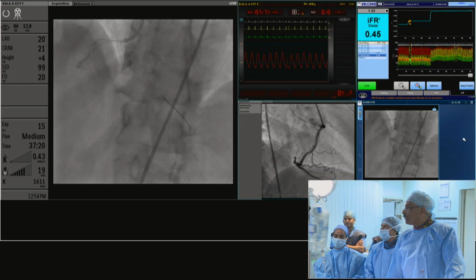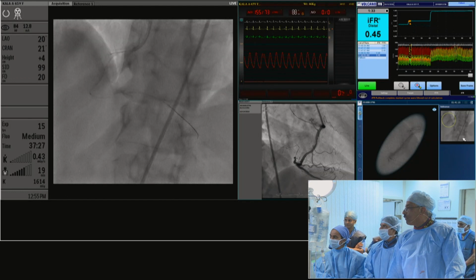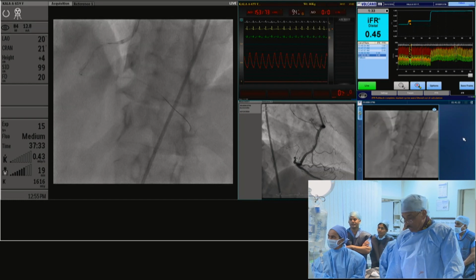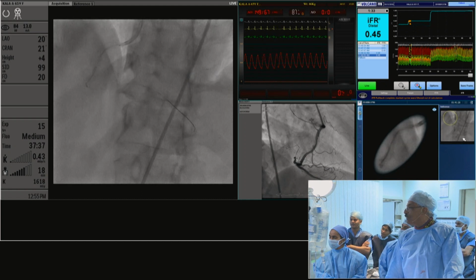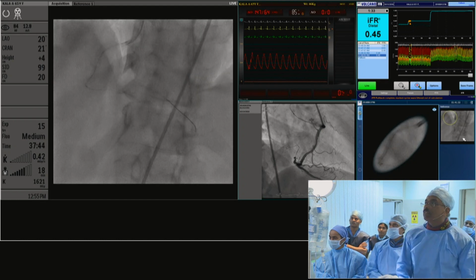Yeah, but you remember that there was a wire whipping out there as well. If you had treated only the PDA, meaning the distal RCA lesion, your IFR would have become 0.85, not 0.9. What you are aiming for is 0.9. So you would have treated both the lesions. You can put 2 short stents, two overlapping stents, PDA and distal RCA. Yes, that's right. 12 millimeter stents would have done the job, to get more than 0.9.